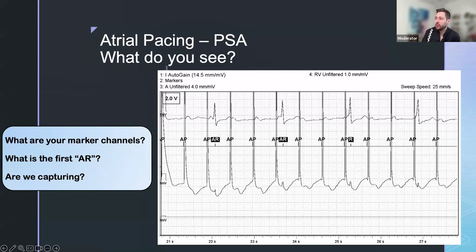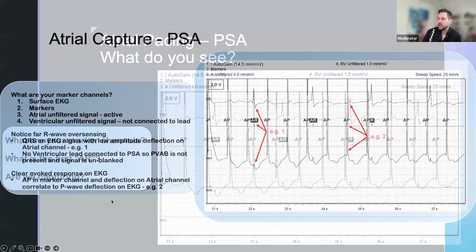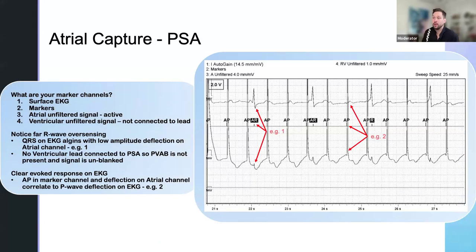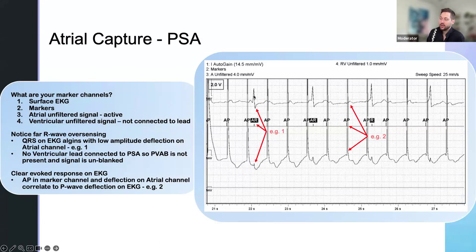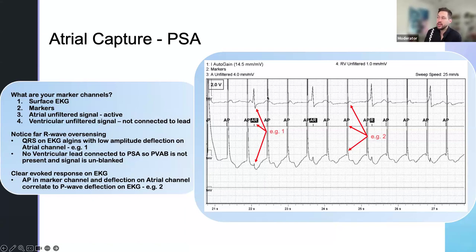What are our marker channels? Our first one is lead one, number two is the markers, number three is our atrial unfiltered signal, and number four is the RV unfiltered signal which is not connected. A deep breakdown of what we're actually seeing: not connected to the lead for that RV signal, which is why there's nothing there. You also notice far-field R wave oversensing. This AR is lining up with the QRS complex — it's the signal of the QRS being picked up on the atrial channel. You can actually see it as a little notch. Because it's set to high sensitivity, it's picking it up. And since there's no blanking — because you have no ventricular channel hooked up — the PSA is in a standard AAI mode only. It doesn't know what's happening in the RV.